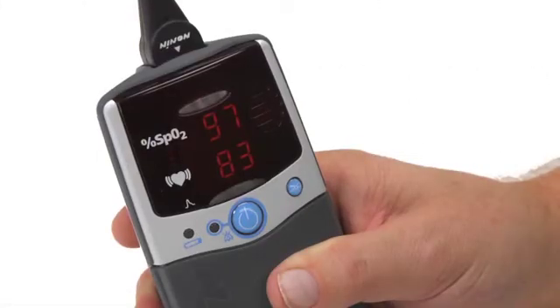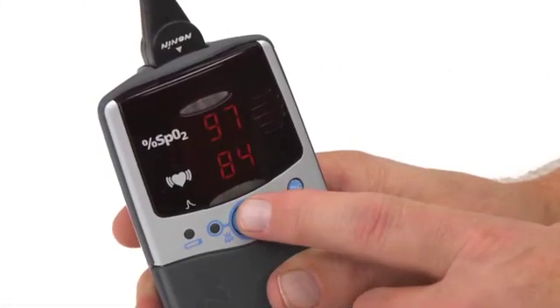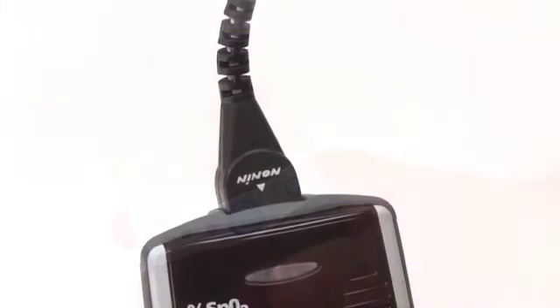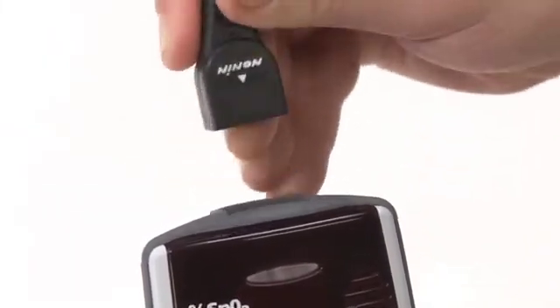When you are ready to stop using the oximeter, simply press and hold the on/off button until the unit turns off. Then you can unplug and remove the sensor.